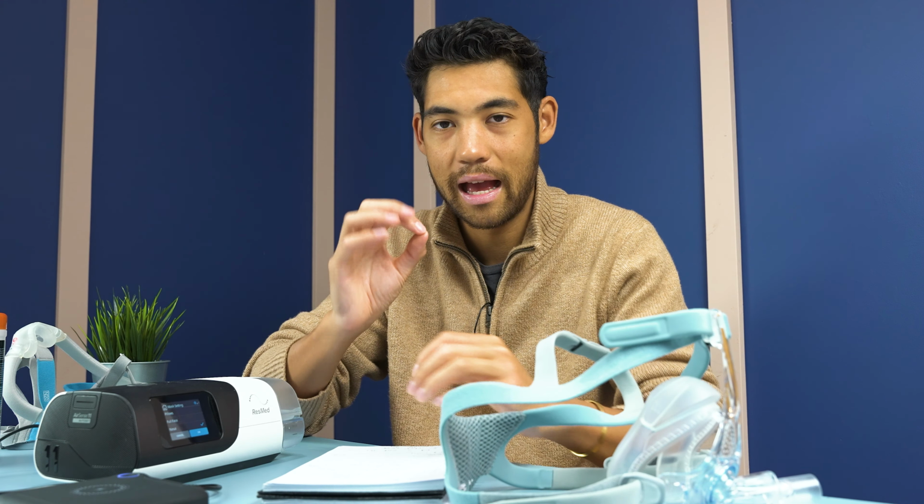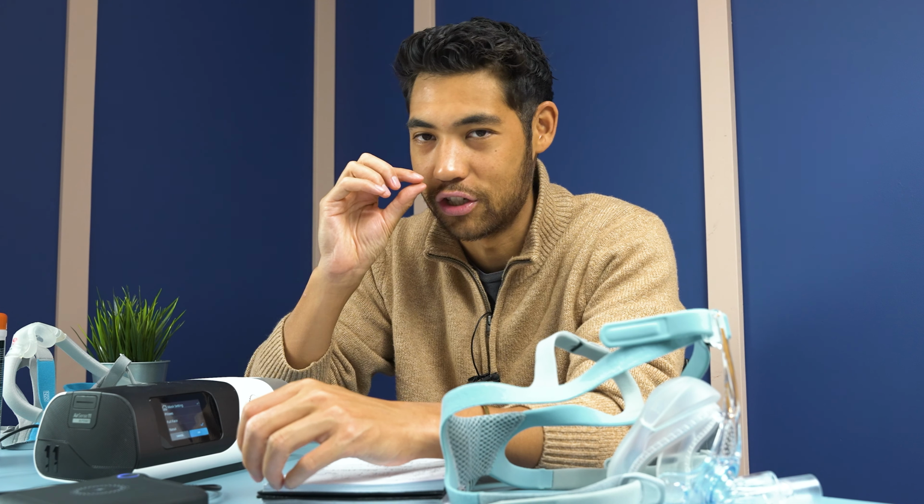Generally, a pillow mask is going to seal a little bit better because there's that extra little bit of silicone, aka the pillow, that wraps on the inside of the nasal cavity. However, that being said, it doesn't go up your nose, it just kind of goes like the first millimeter, eighth of an inch into your nose, but it definitely doesn't go in your nose. So if you're worried about it going into your nose, it's more pressed up against your nose and seals around.